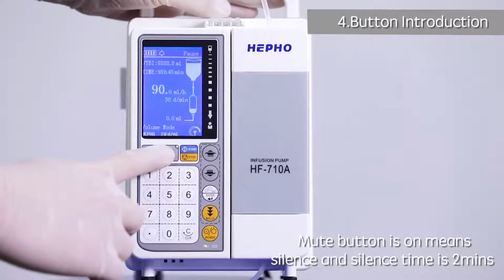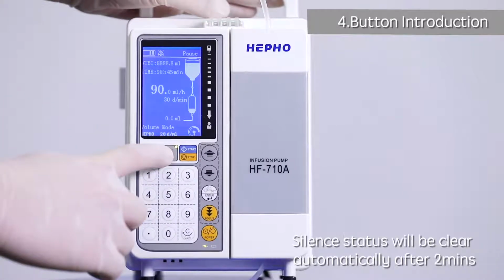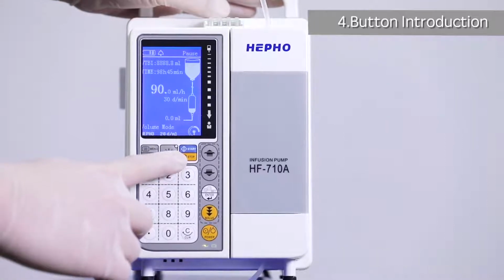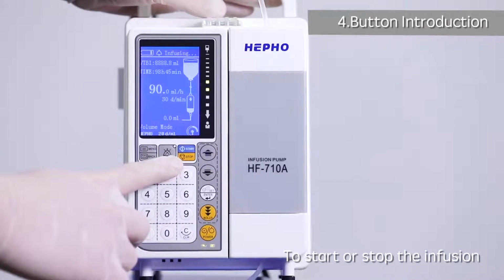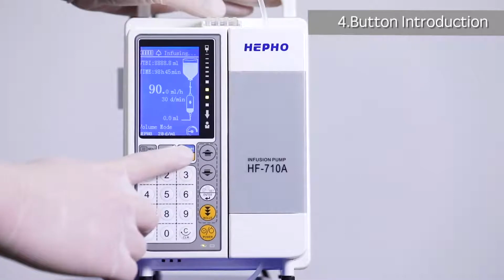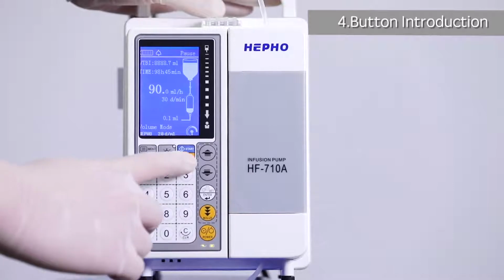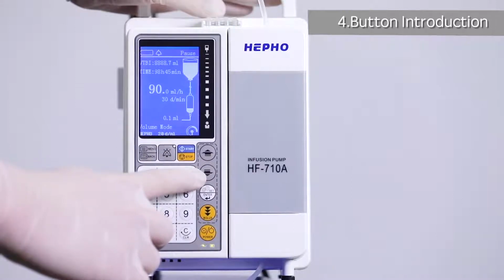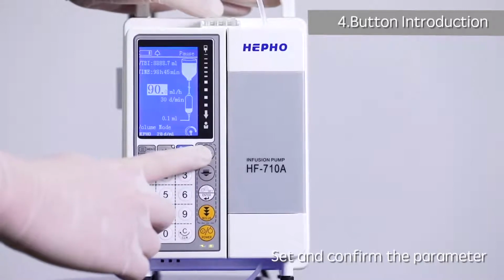Mute button. Mute button is on means silence, and silence time is 2 minutes. Silence status will be clear automatically after 2 minutes. Stop button. To start or stop the infusion. Up, down button. Move to the select menu. Set, enter. Set and confirm the parameter.